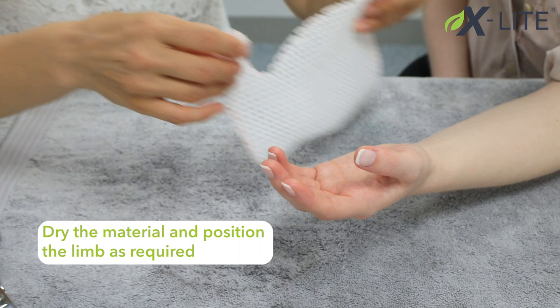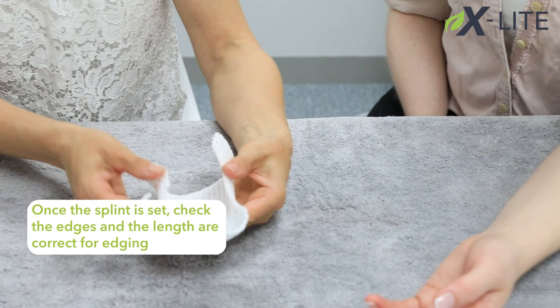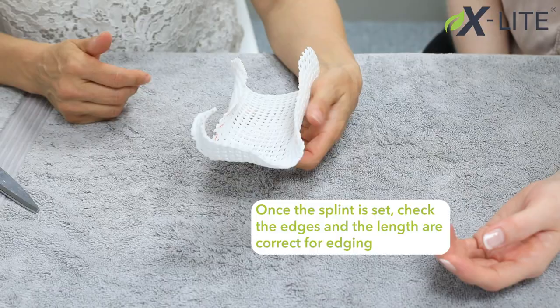Once the material is temperature appropriate, mould the splint on the patient. Once the splint is set, check the edges and the length are correct for edging.